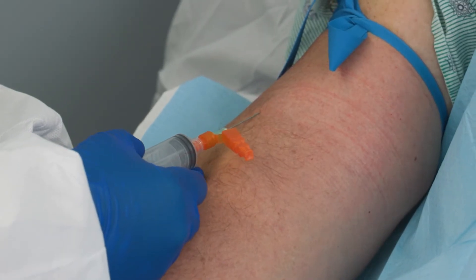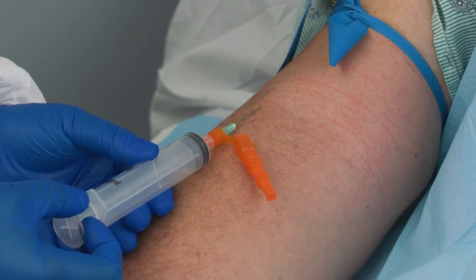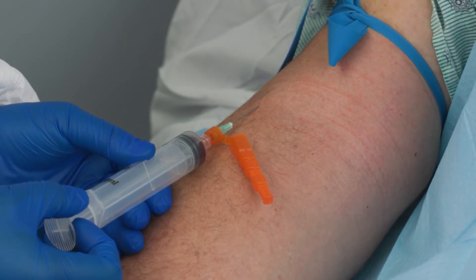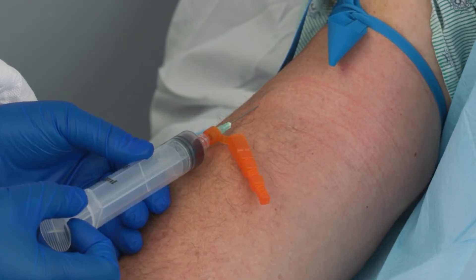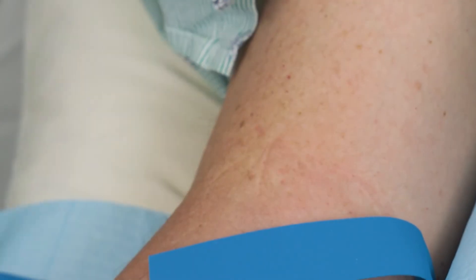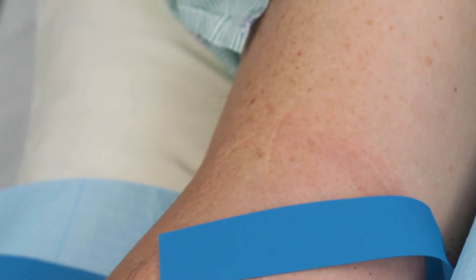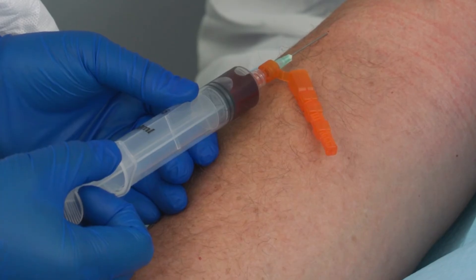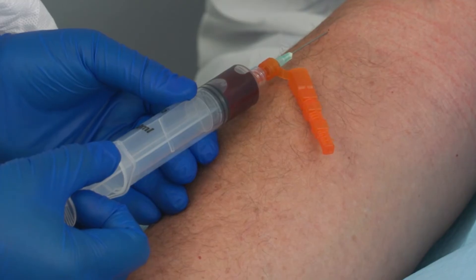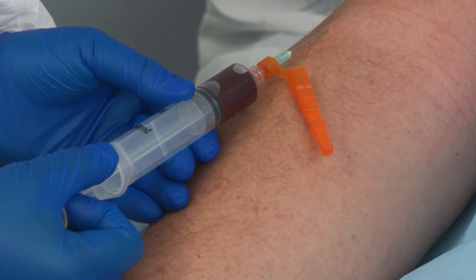Do not repalpate the prepared vein before inserting the needle. Enter the vein swiftly. Blood appearing in the blood collection tubing confirms a successful venipuncture. Release the tourniquet as soon as the blood starts to flow, and always if it has been in place for two minutes or more. For adult patients, always collect 20 milliliters of blood with a syringe. If additional tests are needed, a larger syringe will be required.